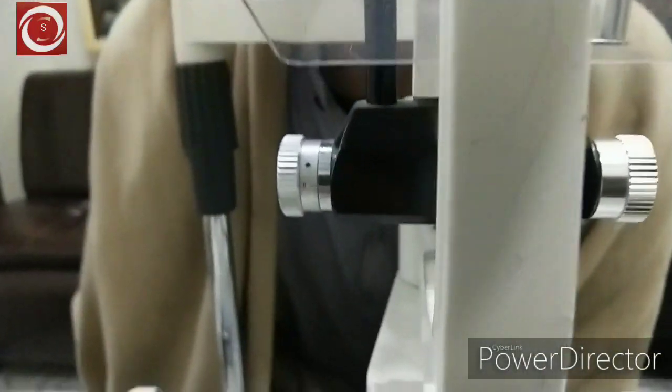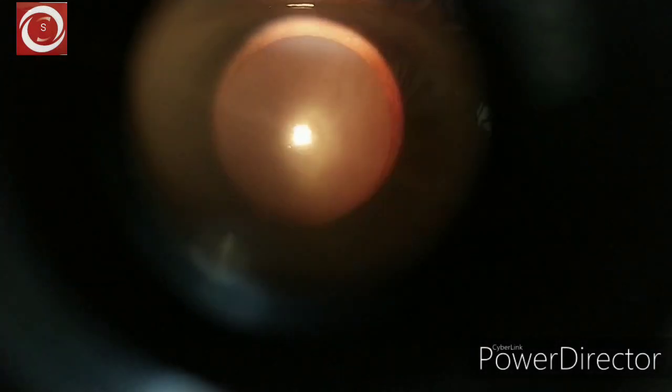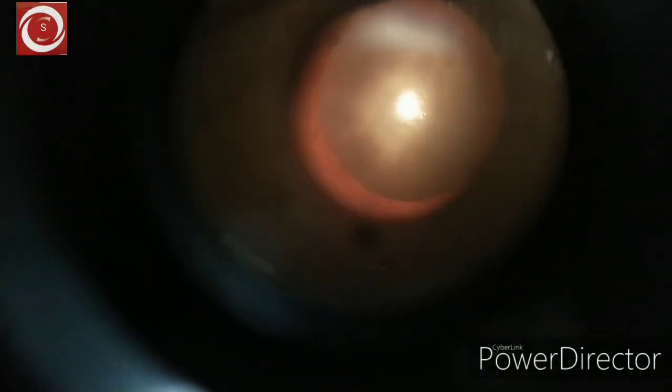Now straight ahead — that's the illumination column. First, diffuse illumination. That's how we are showing you the view. It should be the same whether you open or close one eye or use both eyes. In the right eyepiece you can see the full circle, the dilated pupil, and you can see the posterior sub-capsular cataract.